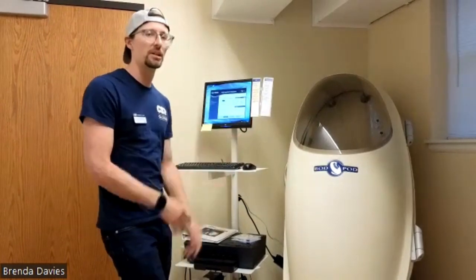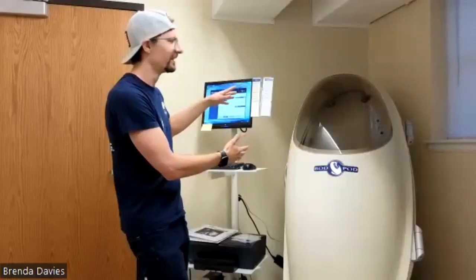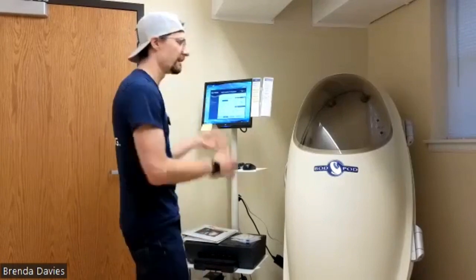The next step is going to be to put the calibration chamber or cylinder into the chamber. Once we put that into the chamber, we can assess that known volume. If we're accurately doing nothing with the chamber, then we can take an unknown.